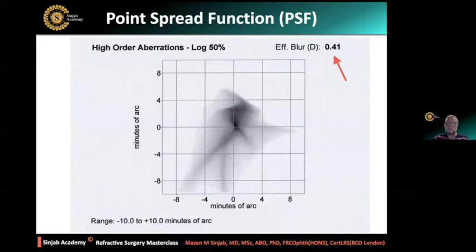So you can imagine what the patient sees and the severity of this, because if you look at this grading, you will find minutes of arc down and on the left. So the more numbers, if the distorted image is distributed over a wider range, it means that it is severe. Whenever it is distorted over a smaller range, it means that it is insignificant or small.